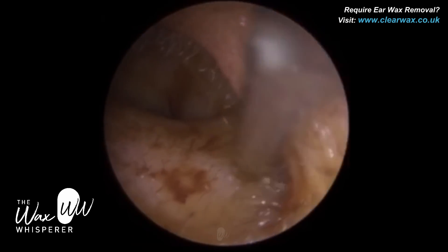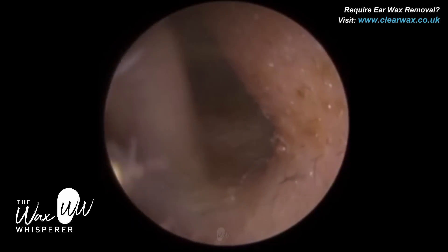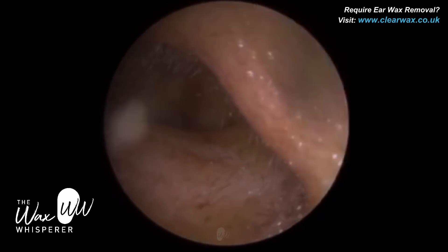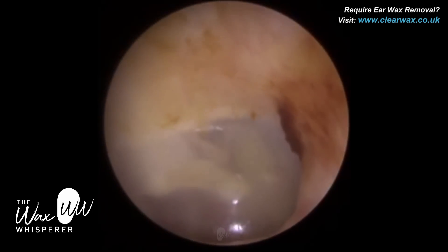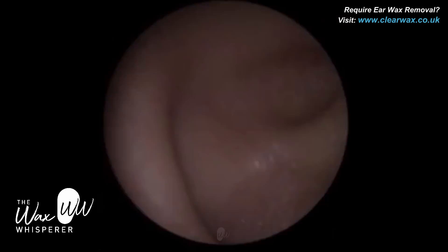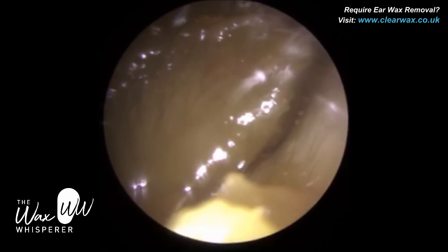Wax is also sticky, so any foreign particles — dust, pollen — that enter the ear can stick to it. As the wax naturally migrates, which is the case in probably 90–95% of the population, the wax carries any embedded dust, dirt, or foreign particles with it. So that was the left ear.